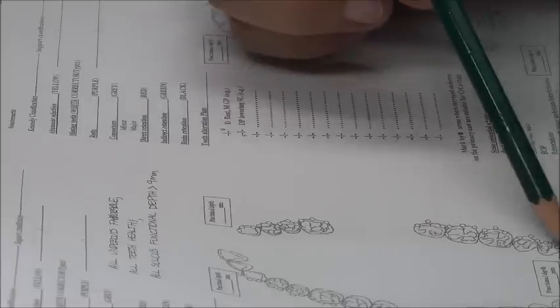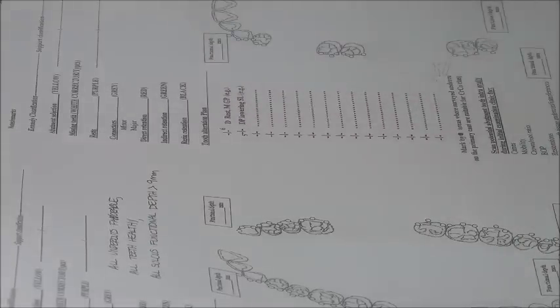Okay? Small bounded areas, anterior. I can place all of my components here, but here I need to add components. Why? For indirect retention here. The cross arch stabilization, I have it. This side is like this side. But I don't have indirect retention. I should have posterior. So here I add components for indirect retention.